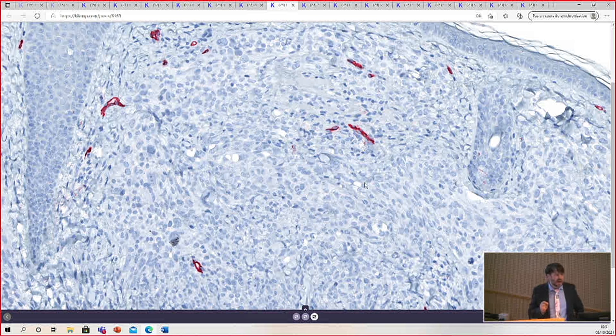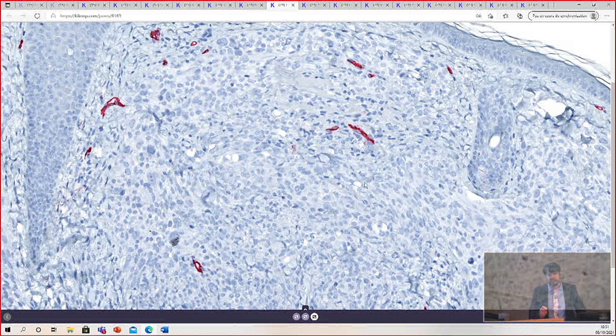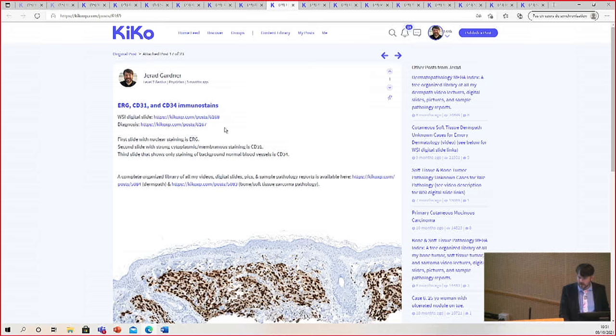So I do not like CD34 as a vascular marker most of the time because of this. No vascular marker is totally perfect, unfortunately. The difficulties, and I've got a little write-up on this if you can refer back to if you need to later.